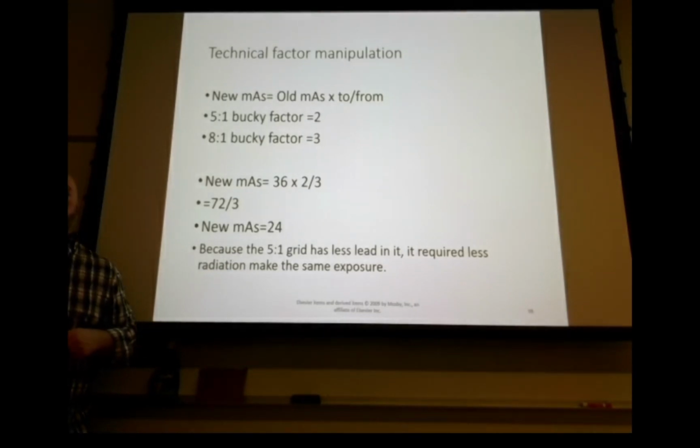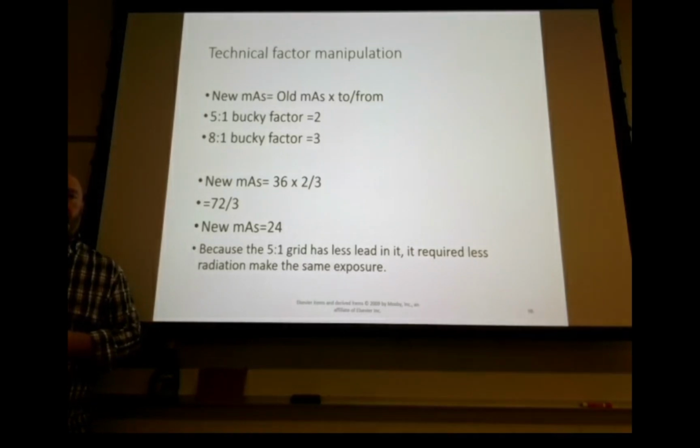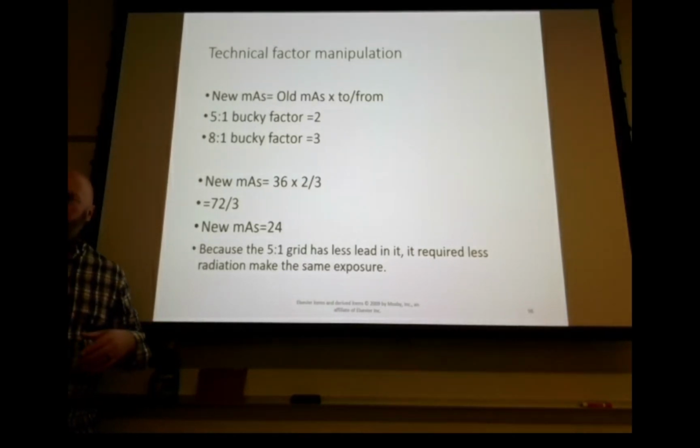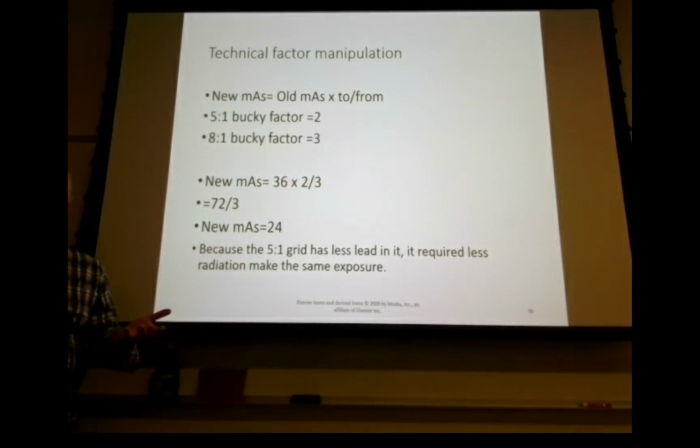Okay, so what do we know about scatter radiation? Post-patient versus pre-patient, what's the energy level of the scatter radiation? It's lower, right. So what virtual grid does is it measures not just the X-rays that come through, but the energy level of the X-rays. Can't really measure the angulation all that well, but it can measure the energy level.